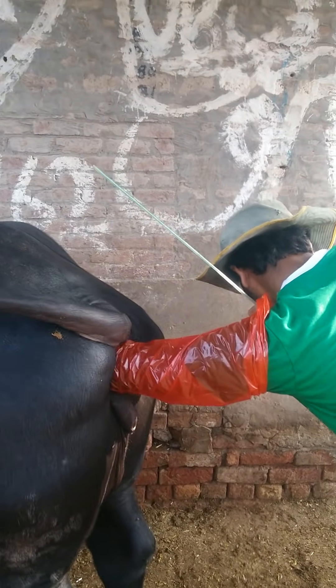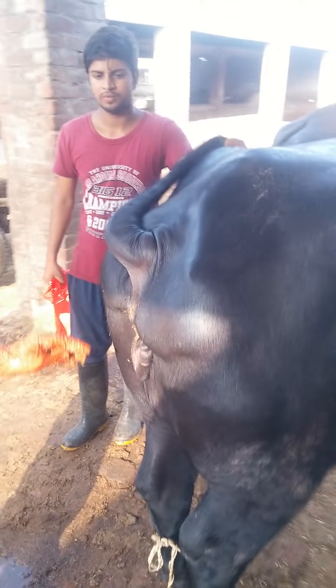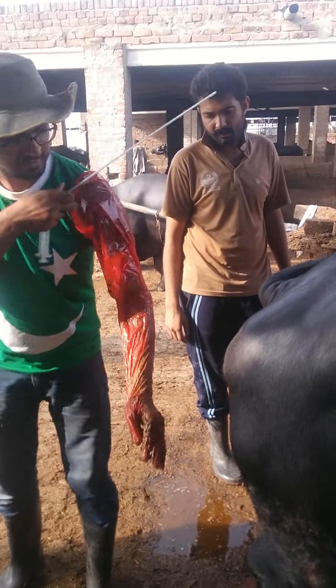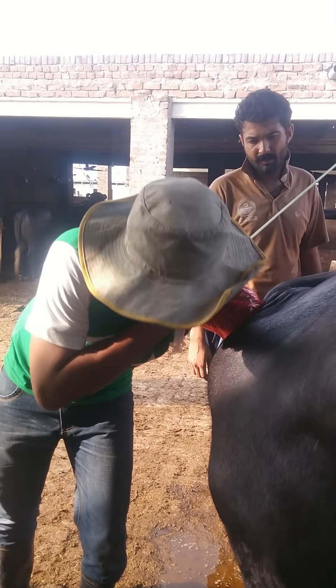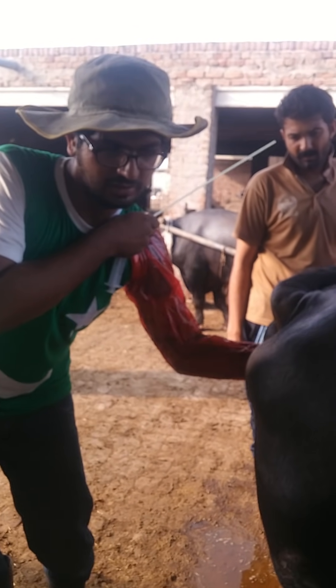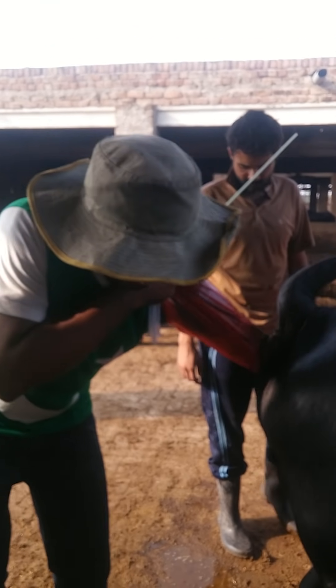The first important step is you have to completely remove all the manure from the track. The track must be clean. There must be no manure in it, as this will hamper your procedure.